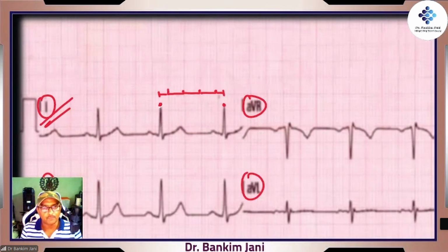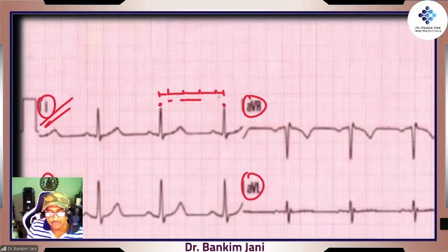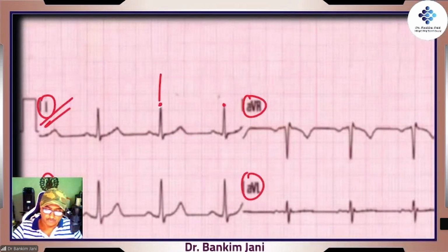So what we are getting here is about one full box, second full box, third full box, and then a slight bit here and here. So overall, there are 4 big boxes. That's the distance. You can see it over here also, from here to here.